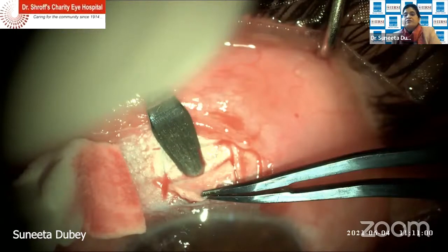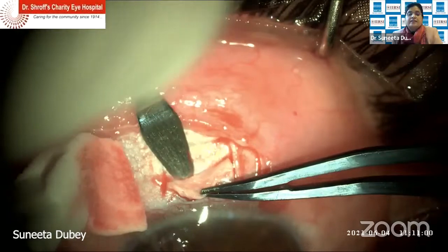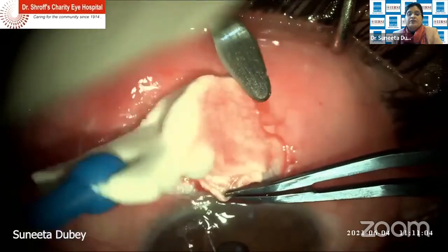Can you just proceed with the surgery, doctor? Yeah. And a 1 millimeter rim always does good on the side. Leave it undissected. And how much thickness do you prefer? 50%? Usually 50%, but it could be lesser also. If you want more pressure drop, then it's 1/3. Yeah, it's 1/3 to half generally. So the thinner the scleral flap, the more the pressure drop.